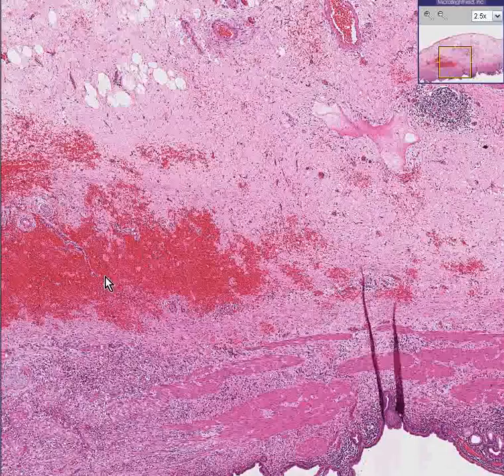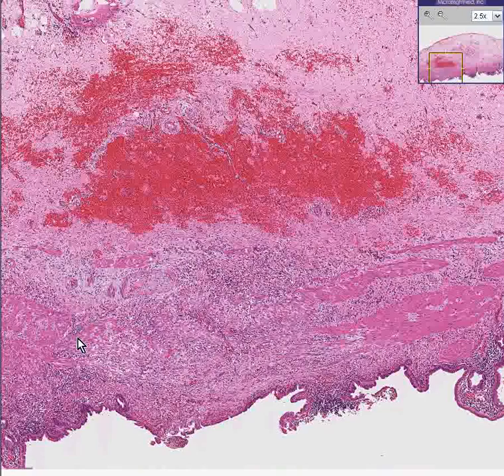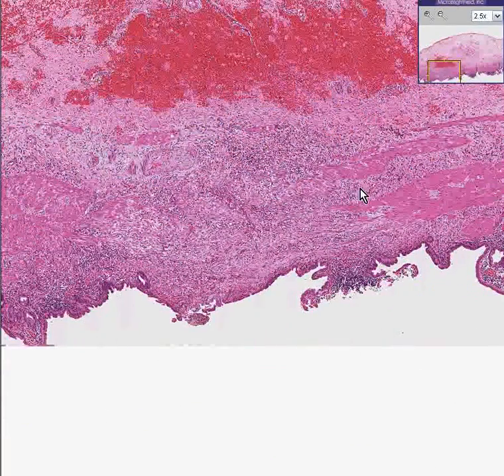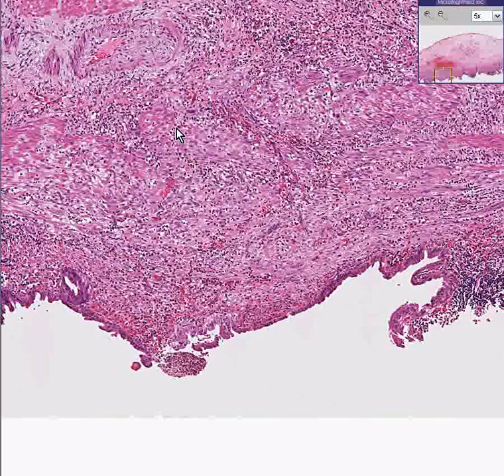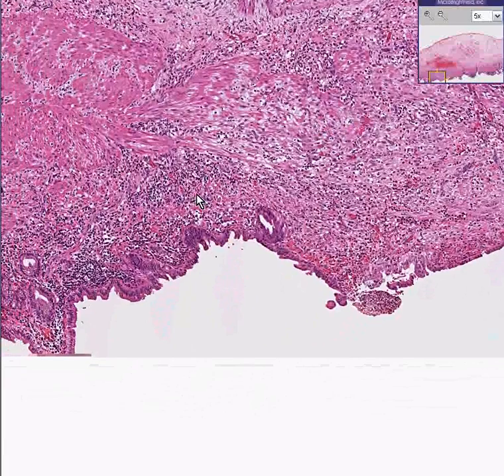Notice that they are associated with some hemorrhage underneath the smooth muscle layer. Also notice that there is significant disruption of this smooth muscle layer. So if this was significantly more disrupted and or acutely inflamed or necrotic, you could expect perhaps some weakening of the integrity of this wall, which represents a big risk factor for perforation, which would cause peritonitis.